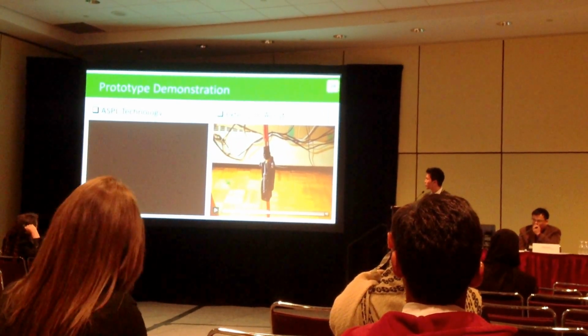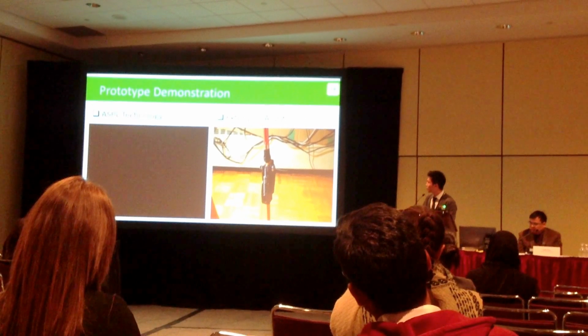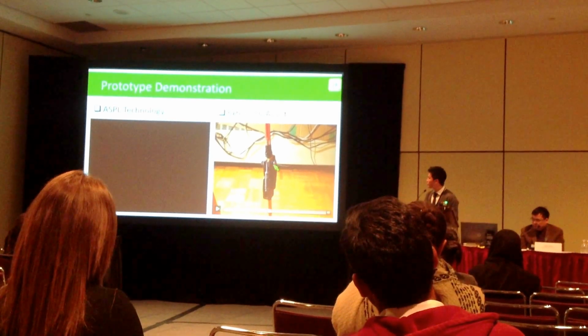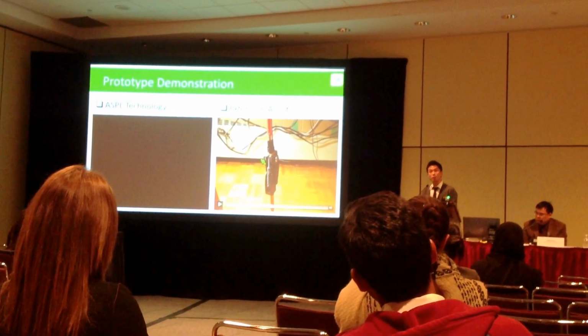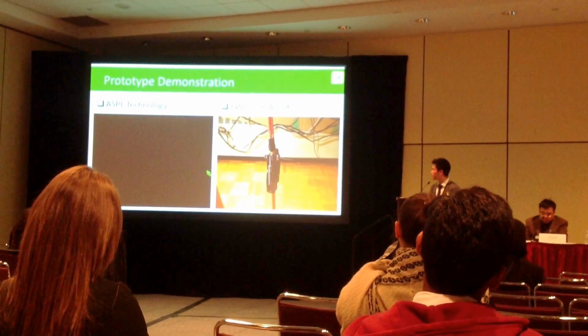I just want to draw your attention to here. For the mechanical friction control, there are two shims between the top part and the body part, which provide friction between the interface. And on here, there are two knobs that allow the users to tweak and adjust the friction to suit their walking style or walking speed.